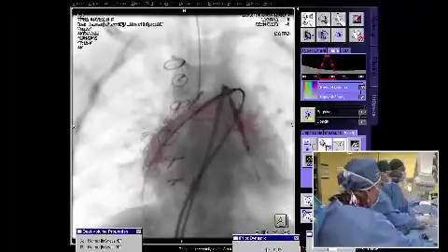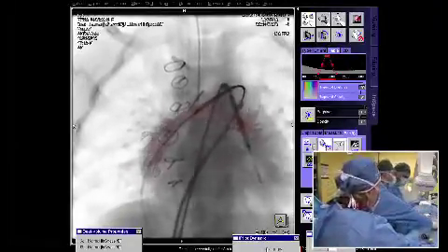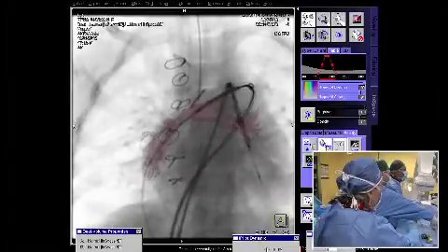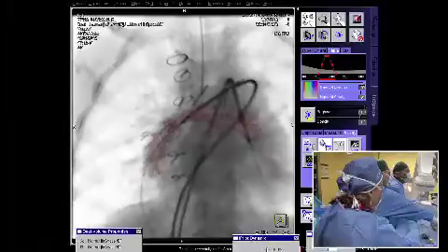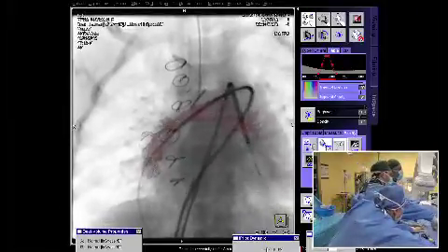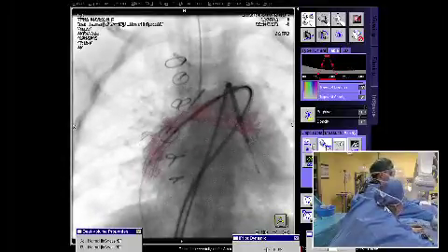Gianfranco, this is Iyad. Yeah. I'm really concerned about the placement of two stents to get rid of the stenosis in both arteries, because to me clearly there is significant narrowing in the LPA and the RPA at their origin. And to treat the origin stenosis, both your stents have to extend into the MPA.